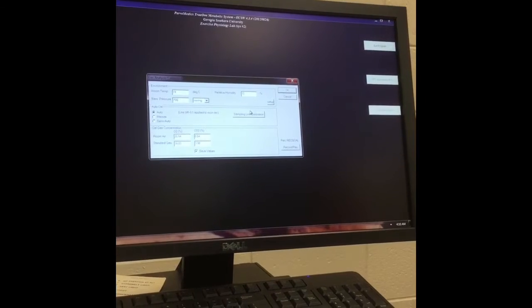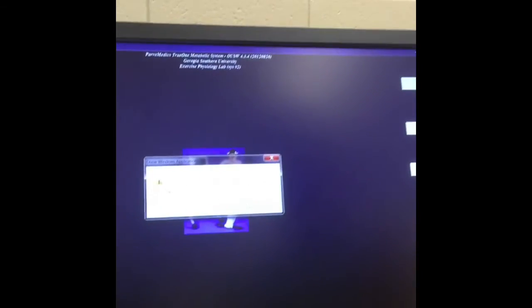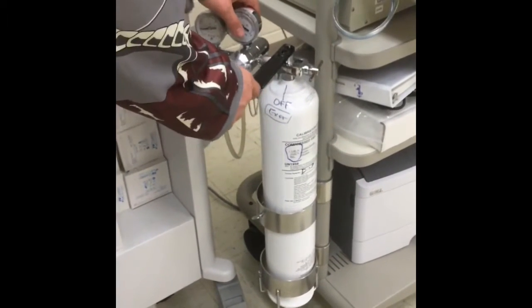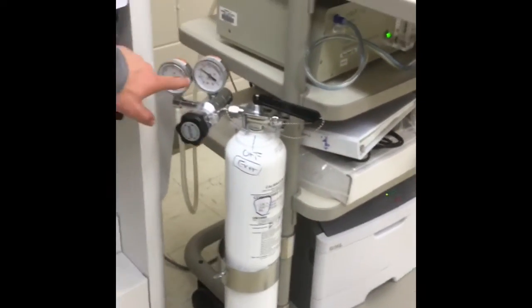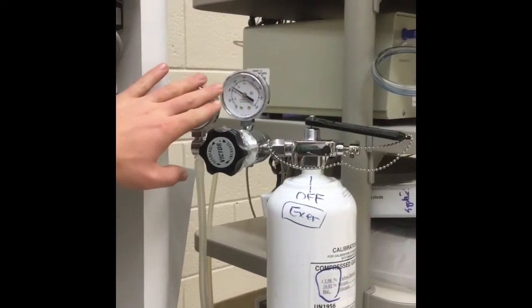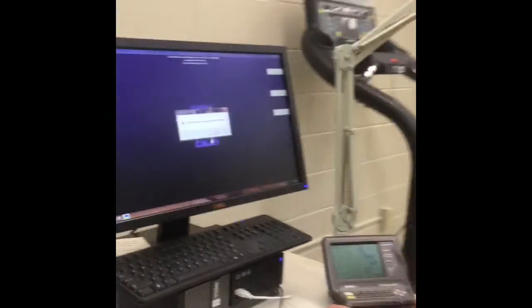Next, click OK. You'll see it says to turn on CalGas to 3 PSI. Come over to the valve, which is currently in the off position, and turn it 90 degrees to the right. You should see the reading come up to less than 5 PSI, and the values should be going up. Then click OK, and it will run a 15-second analysis.